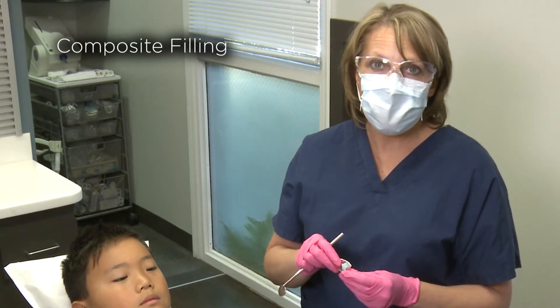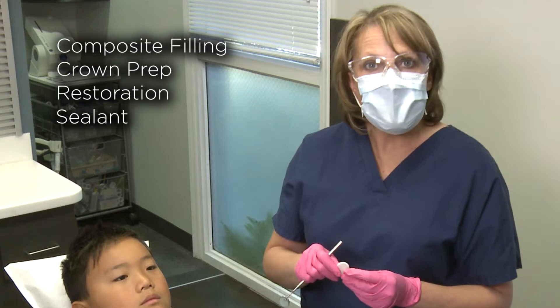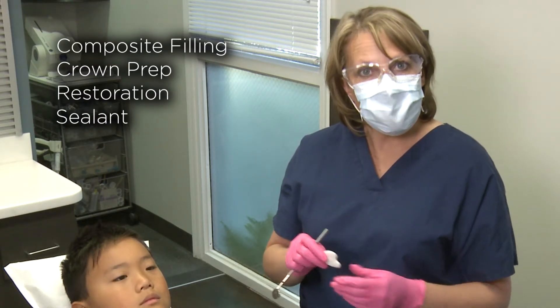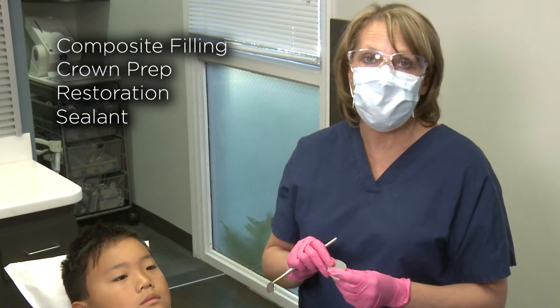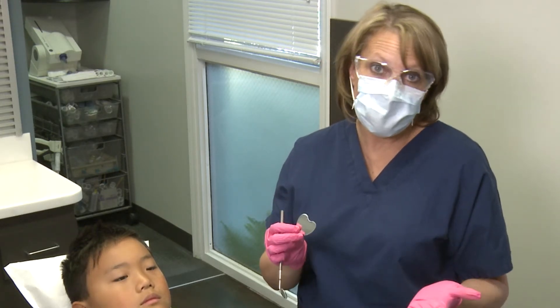Whether doing a composite filling, crown prep, restoration, or sealant, its super absorbency prevents the need to change the cheek retractor in and out multiple times. Hygienists love them because they're not used to having to keep a dry field.